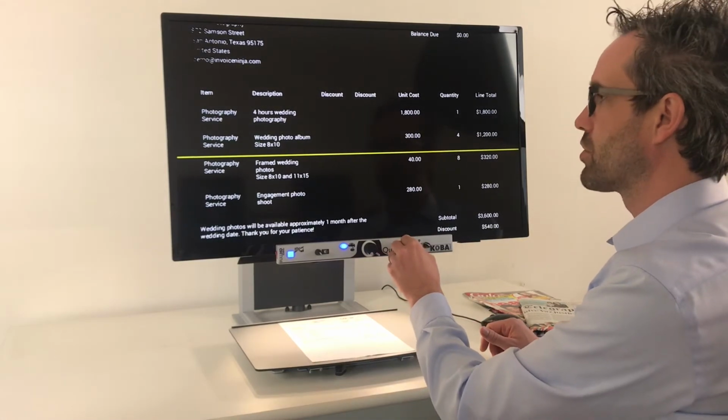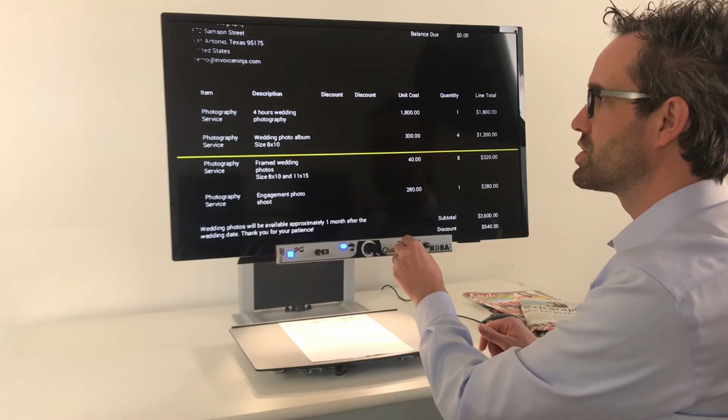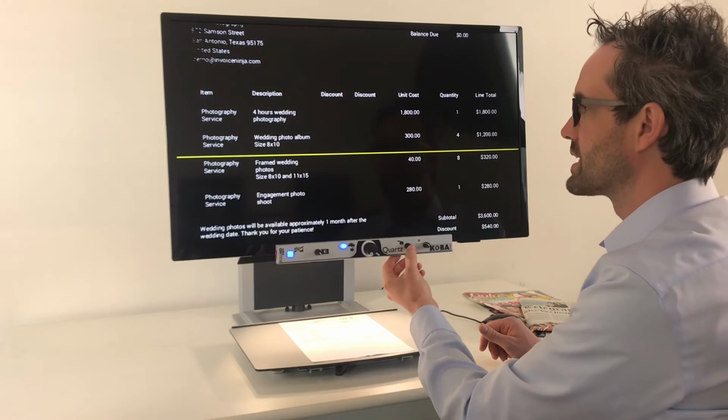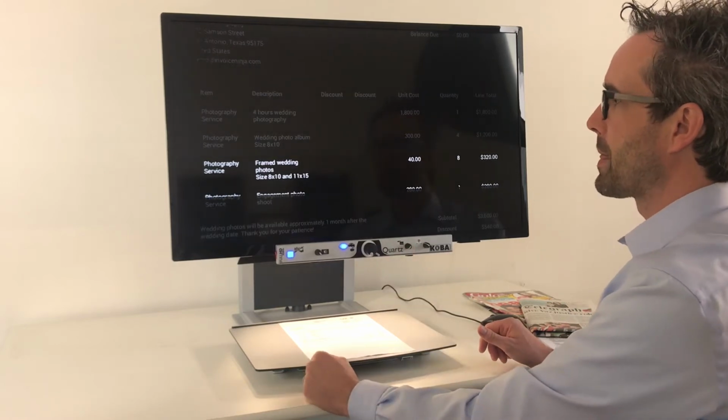By pressing and turning the button at the same time, you also can change the color: red, green, cyan, white, black, yellow. If you press again, you get a bar. You also can turn to set bar position.